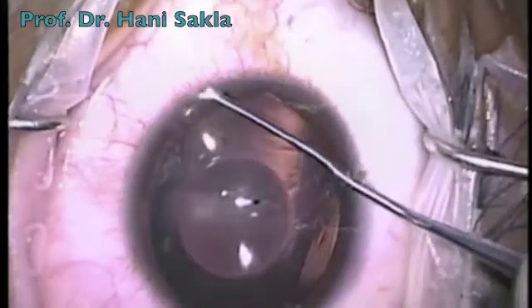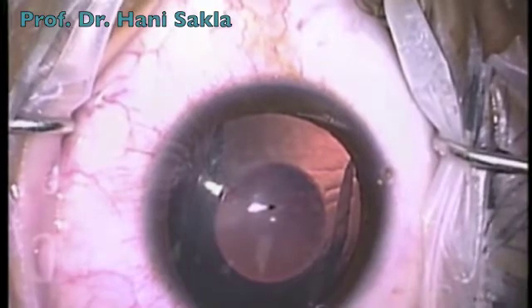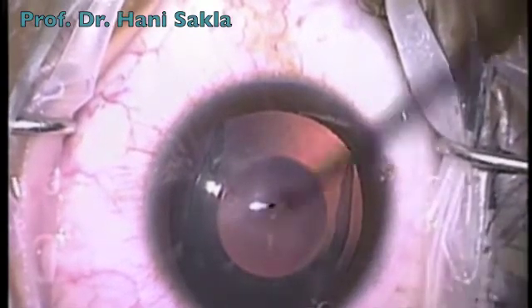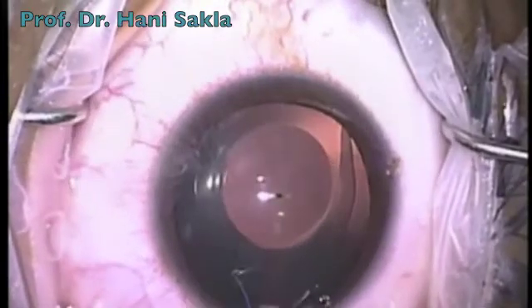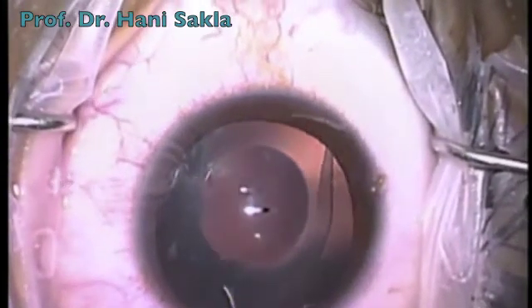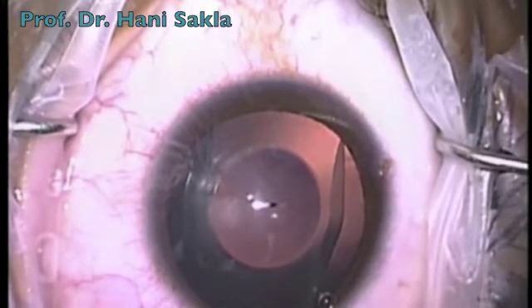Then through the main incision, we place the optic on top of the ICL and the proximal haptics of the ICL behind the iris. We rotate the lens to align the axis of the toric ICL in the direction and axis we want it placed in, to correct the astigmatism.